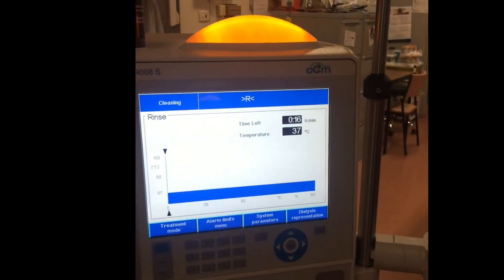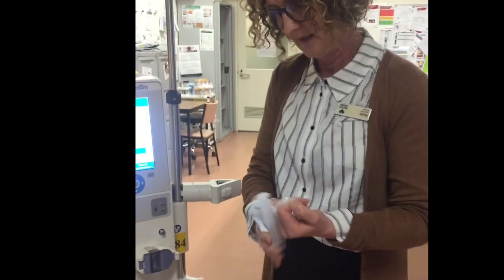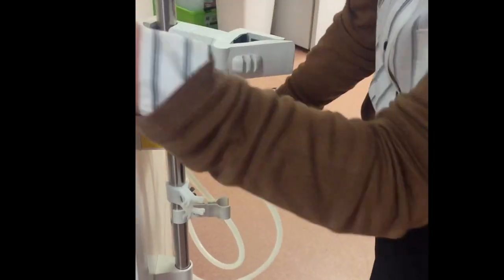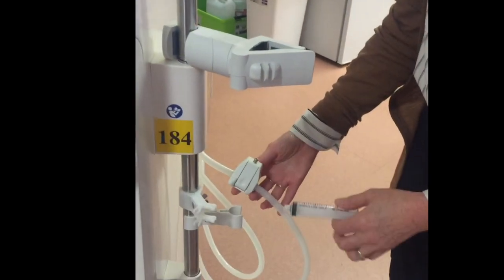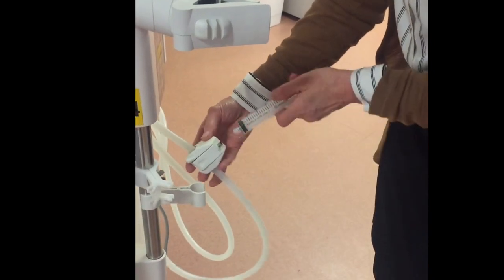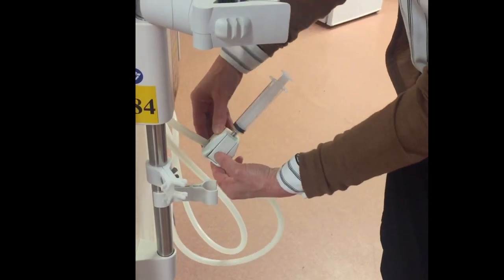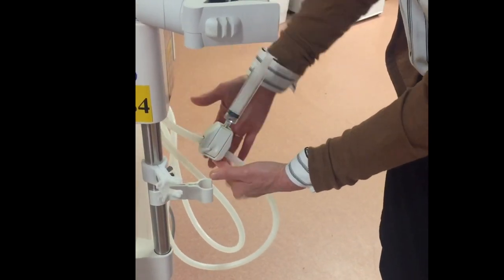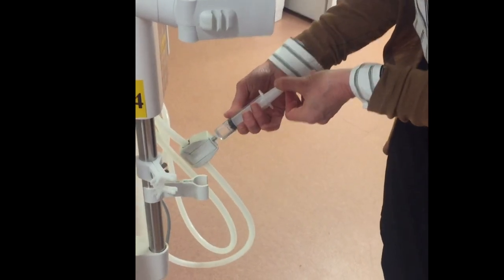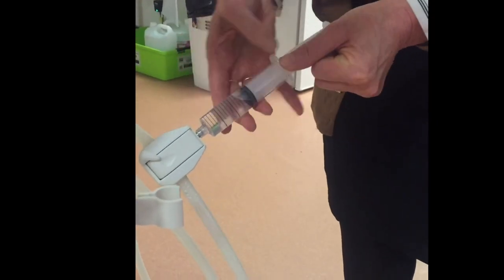I've got a 20 ml syringe, and I'm going to take a sample. Any time during this rinse you can take a sample from your sample port on the blue dialysate hose. Lock the syringe in there, hold the plunger down, and gently pull out about 20 ml of the rinsing fluid.